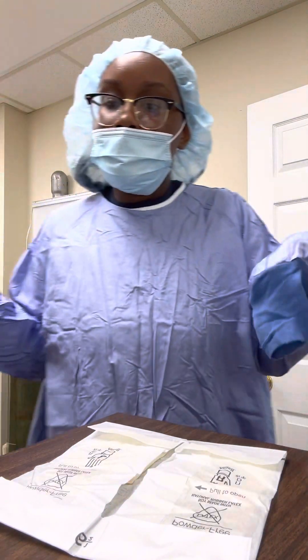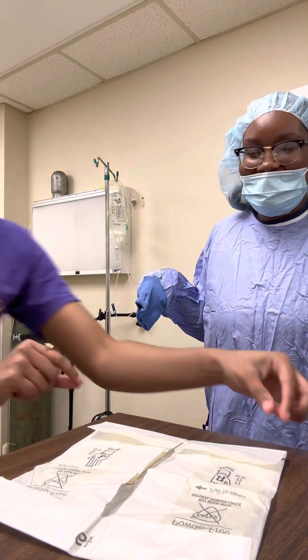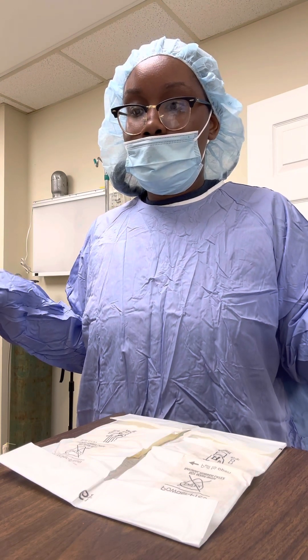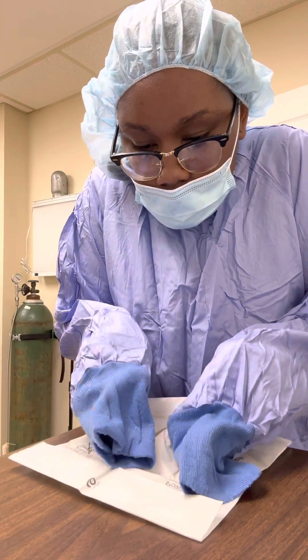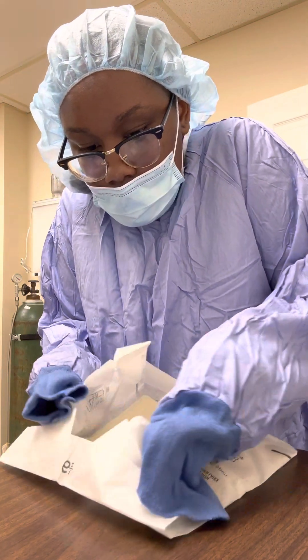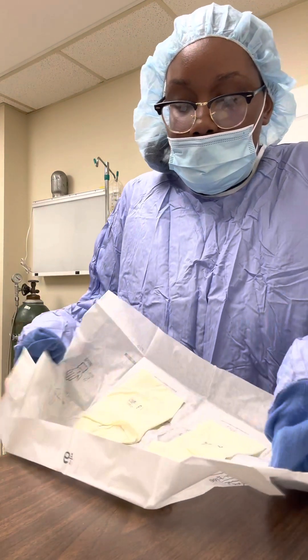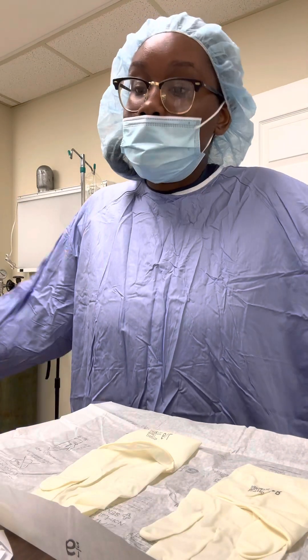Now that she's opened my gloves, I can scoot it a little bit — scoot it at the edge of the table. And now that she's done that, I'm going to open the inner of the glove packaging with just the sleeves. This is a little tricky, but I got it. Now that's open, so now I'll be gloving up.